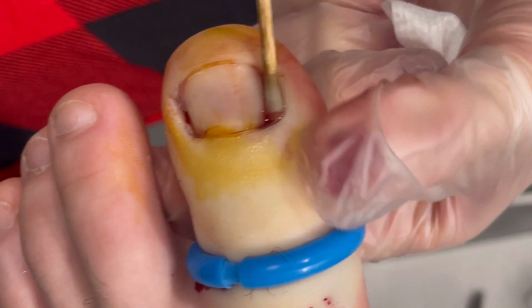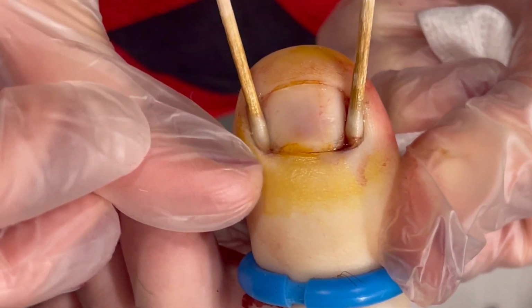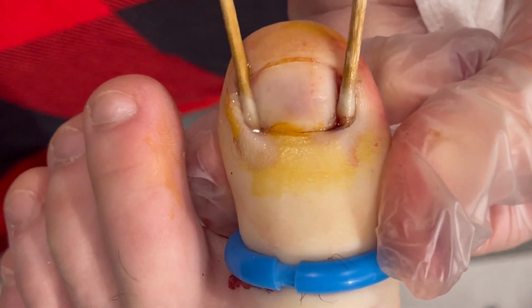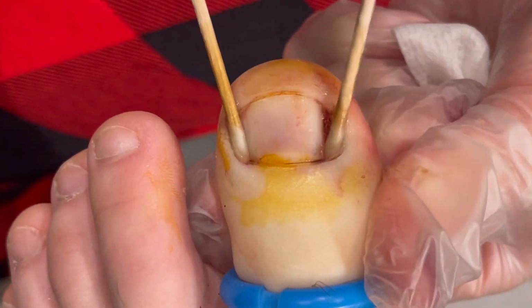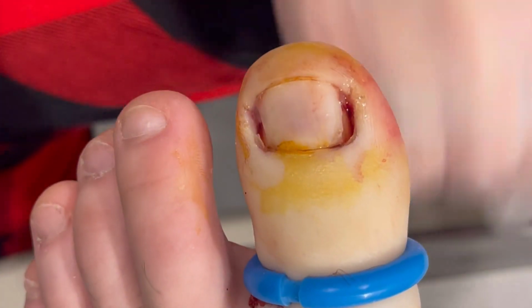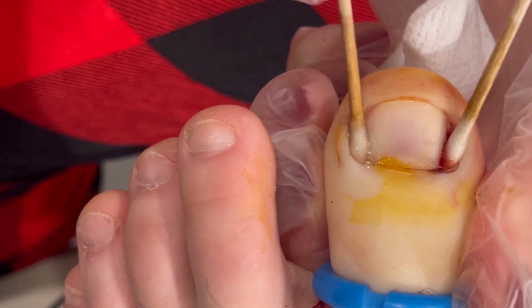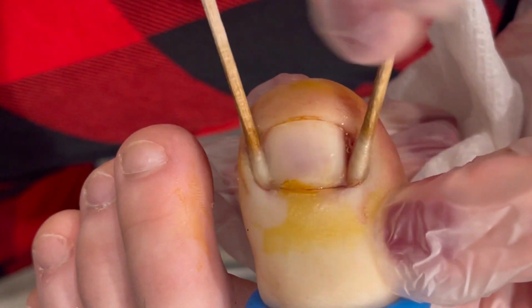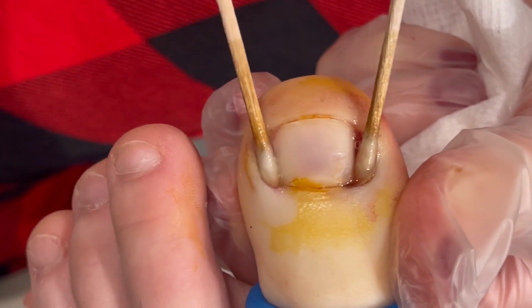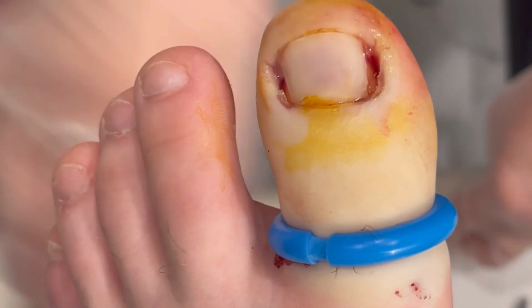This is sodium hydroxide. It does create a chemical burn like we talked about on the other one. You saw how he got those blisters down here. That's because this Q-tip goes all the way up under his skin, and it is burning him. This would be torture if he wasn't numb. Last one, 3 applications, about 10 seconds each. Making sure to get way down in there and get the root of it. Alcohol, I lied. Vinegar is what neutralizes this. So he will smell like an Easter egg.